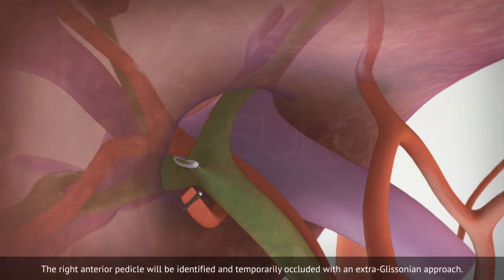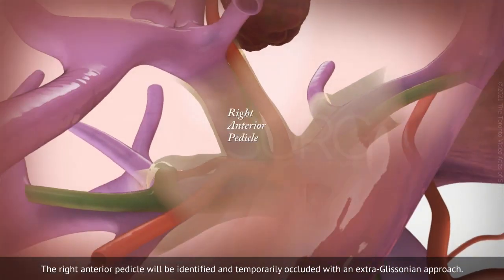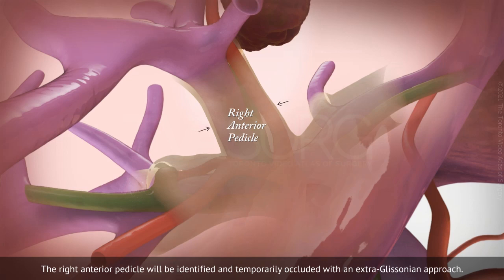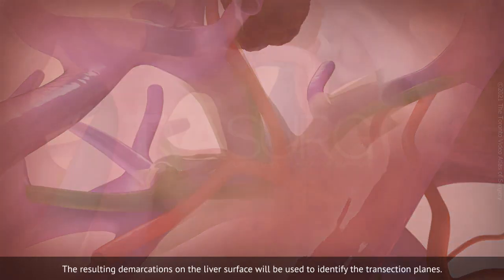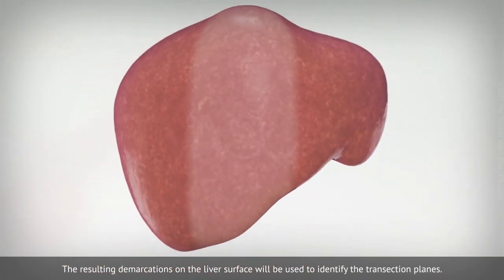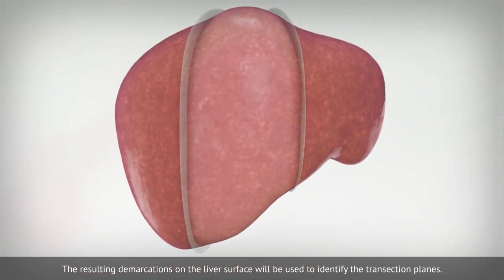The right anterior pedicle will be identified and temporarily occluded with an extraglissonian approach. The resulting demarcations on the liver surface will be used to identify the transection planes.